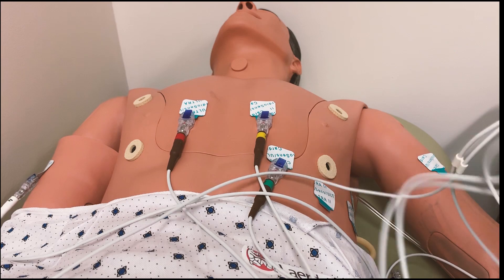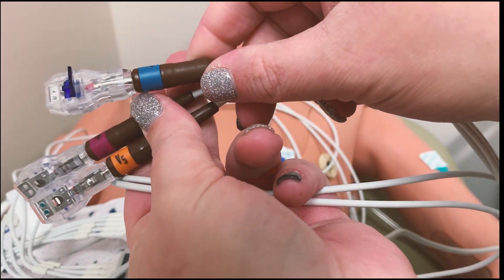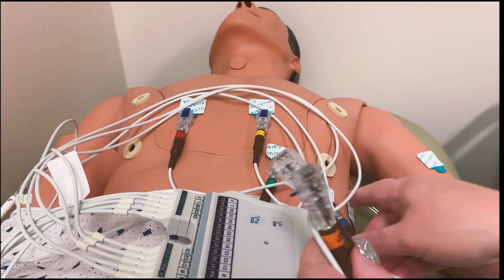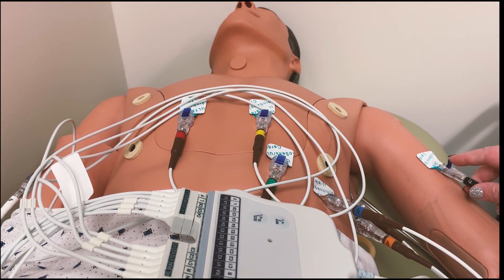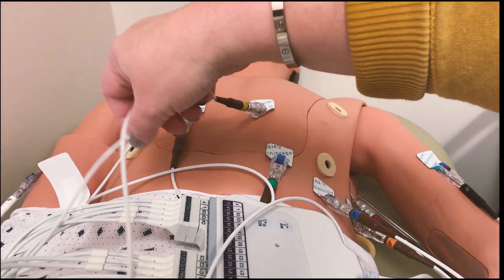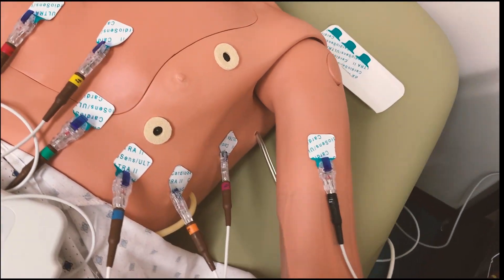Then we repeat the same thing with the left side — V4, V5, V6, and left arm. I lay the harness right here and get all the wires out of the way so they're not tripping up anywhere. Make sure all my leads are pushed down. Now, if your leads won't stick, take an alcohol pad and rub it on the skin to remove any oils or lotions. This is about what it should look like when the patient is all hooked up and ready to go for their EKG.